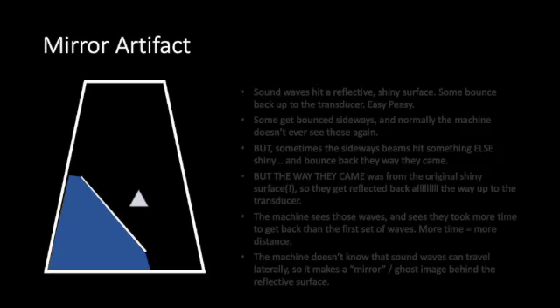Mirror artifact occurs because sound waves will reflect off of a variety of different places inside the body. And sometimes when those reflections are happening against something that reflects really, really well, something really shiny and linear like a diaphragm, or sometimes a bone, or sometimes a tendon, what we can see is a mirror image that's artificially generated because of the machine. Let's see how that happens.